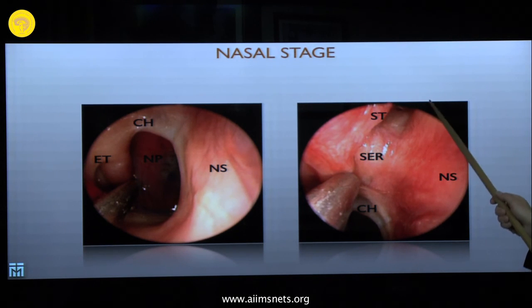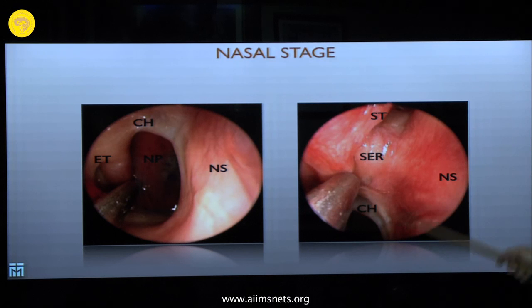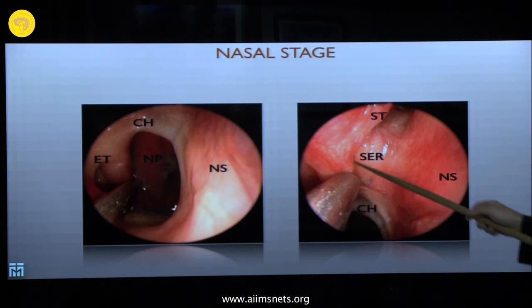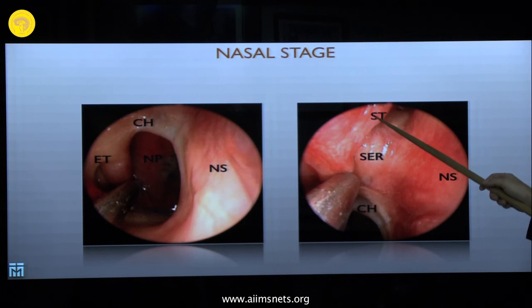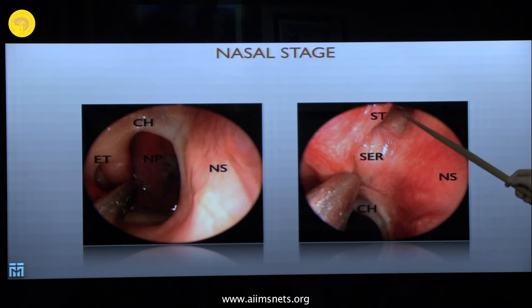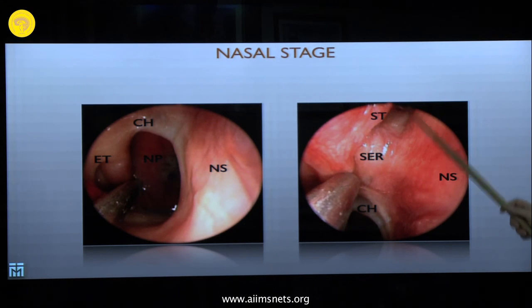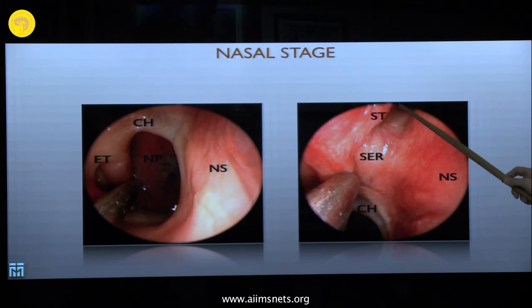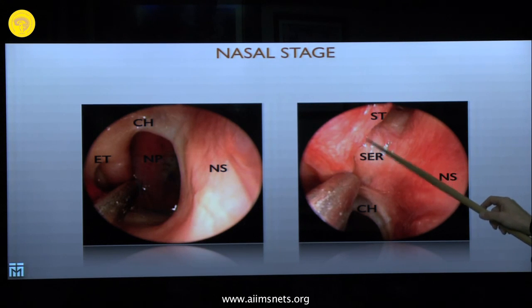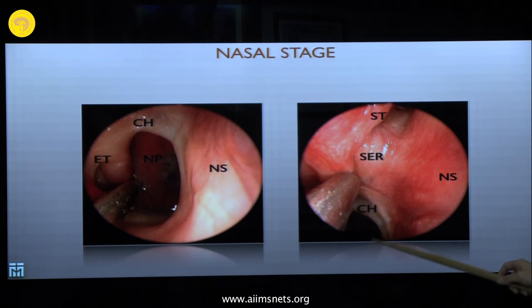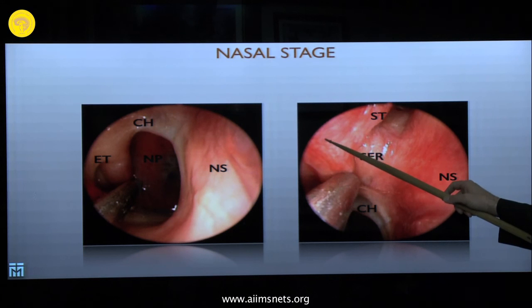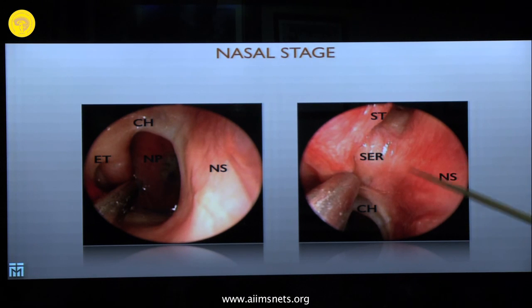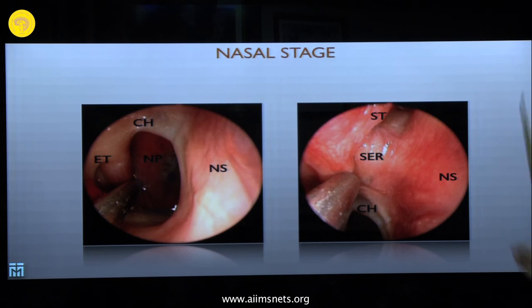Lifting the endoscope slightly, you can identify the coanae and nasal septum, the attachment of the middle turbinate, and the attachment of the superior turbinate. You also see a small hole — the ostium to the sphenoid sinus. The bony opening is much larger than what you see here. This area is called the sphenoethmoid recess. Key landmarks: nasopharynx, coanae, nasal septum, middle turbinate attachment, superior turbinate, and the anterior wall of the sphenoid sinus.